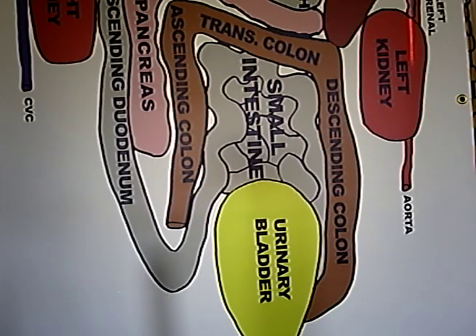The pattern of exam portion of the General Abdominal Scan DVD presents the process of moving from the left adrenal to the urinary bladder in a zigzag pattern to examine intestines and colon in the left caudal quadrant of the abdomen.